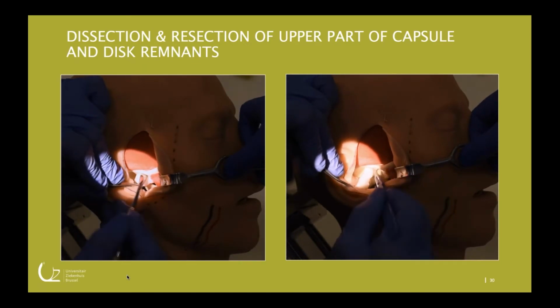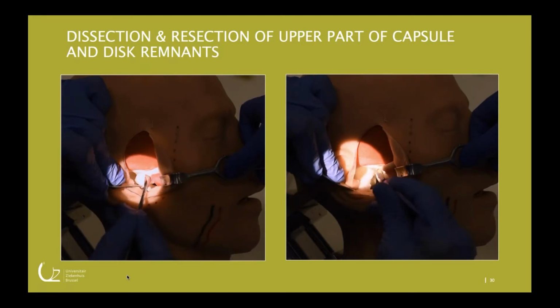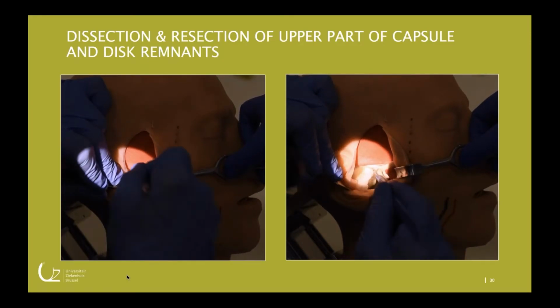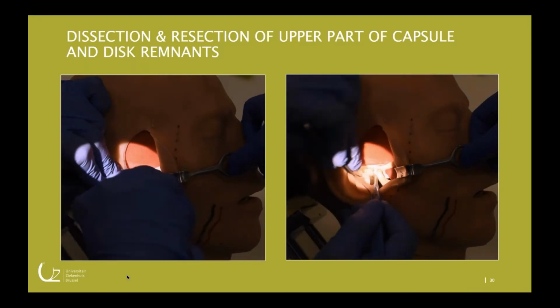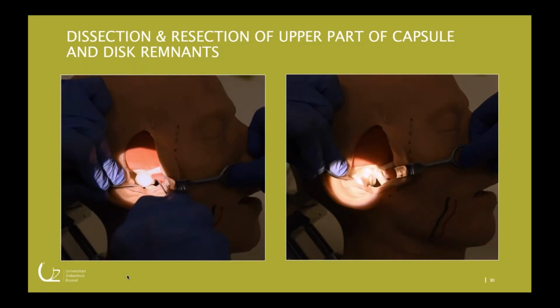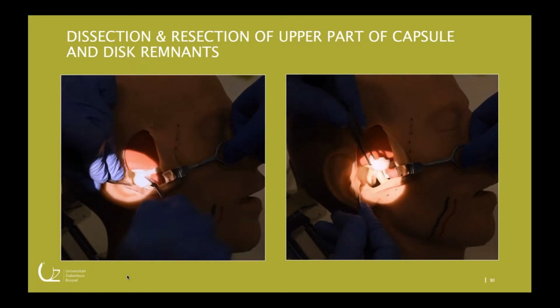And that exposes the condylar head. There is still tissue to be removed, medially soft tissue, but that will be done later.